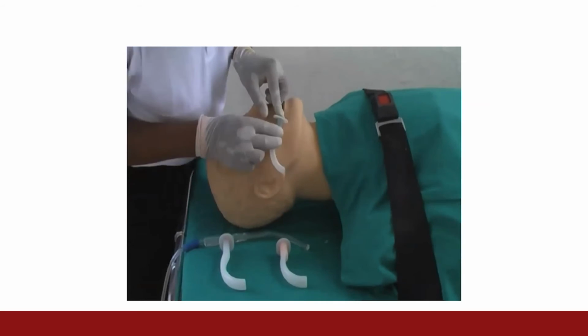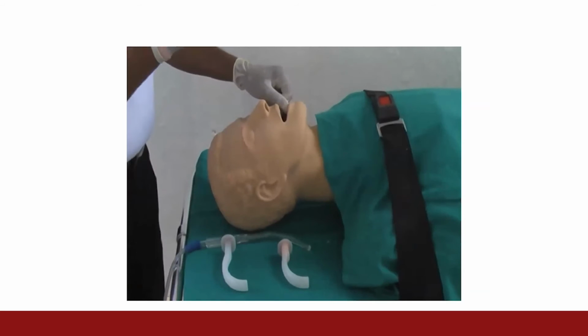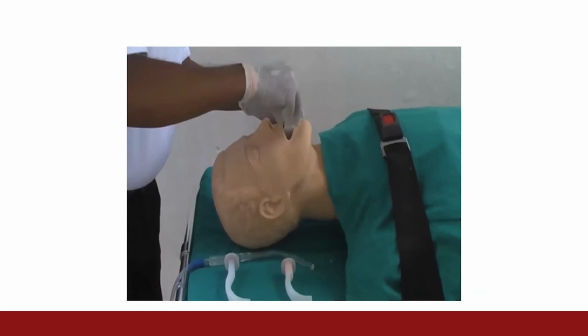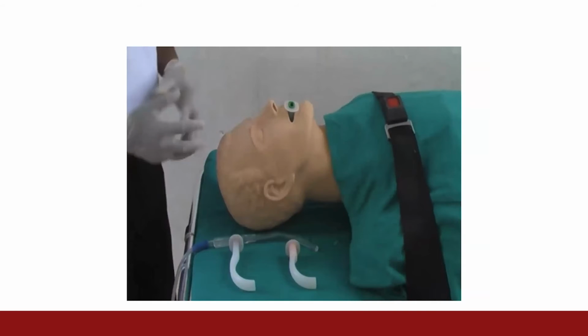The provider then selects an appropriately sized oropharyngeal airway, opens the mouth using the scissors technique, and places the airway in the mouth facing towards the top of the head, rotating it 180 degrees once it touches the roof of the mouth and advancing it until the flanges rest on the patient's lips.